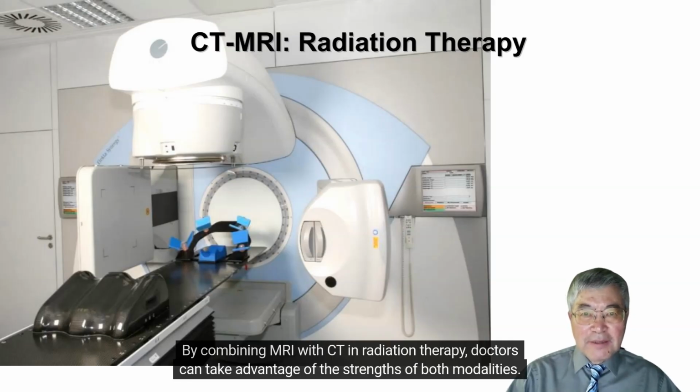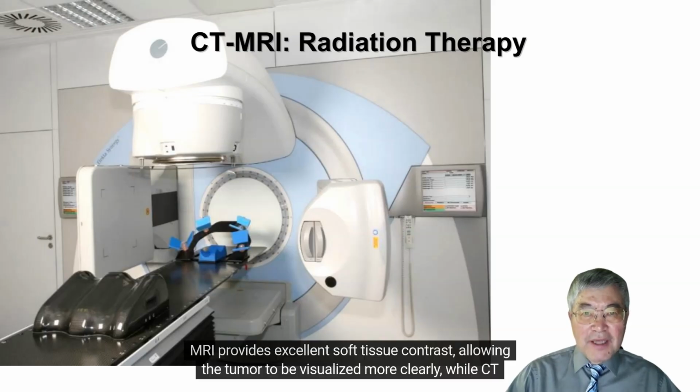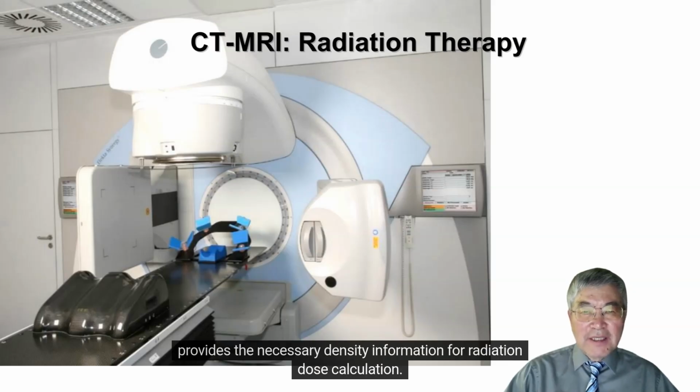By combining MRI with CT in radiation therapy, doctors can take advantage of the strengths of both modalities. MRI provides excellent soft tissue contrast, allowing the tumor to be visualized more clearly, while CT provides the necessary density information for radiation dose calculation. This hybrid approach makes the targeting more accurate and safer.